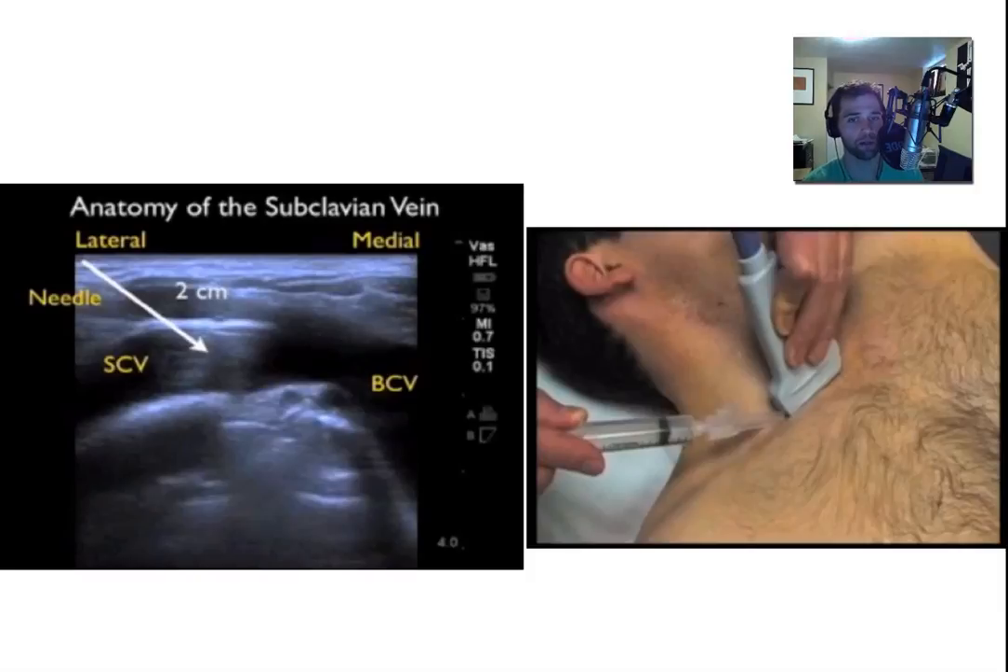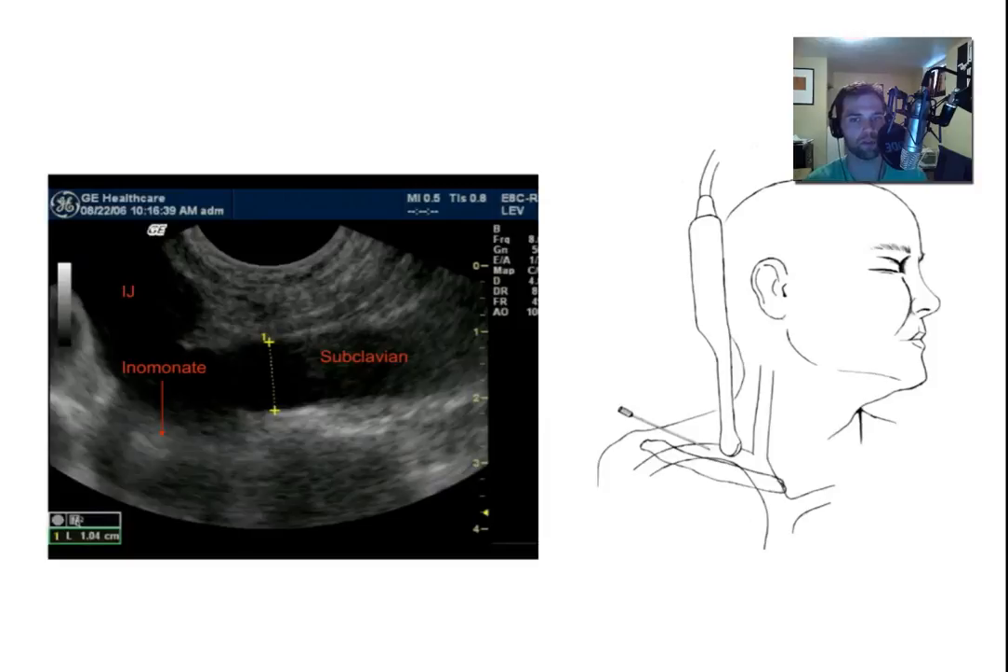It's a pretty easy procedure. You do have to do it in long axis — there's not really enough room in this area to do it in short axis. This has also been described using the endocavitary probe, where you can put the endocavitary probe in the supraclavicular fossa, right up next to the clavicle and the sternocleidomastoid muscle, and point down into the chest just like you would with the vascular probe. You'll see the IJ and the subclavian form together to make the innominate. Keep in mind there is a valve where the subclavian and the IJ connect, which you'll often see on ultrasound — nothing to worry about though, you can pass a catheter straight through that area.